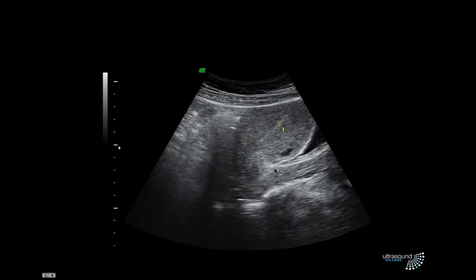And here's that picture of the patient with an empty bladder. Here is the uterus, cervix down here, this is the endometrial stripe, here's the empty bladder, and this is the vagina. Here is bowel gas behind here, and we've actually just missed the symphysis pubis shadow there.